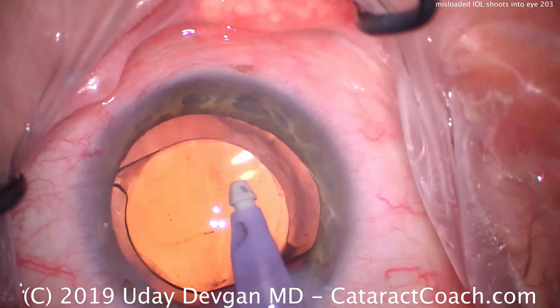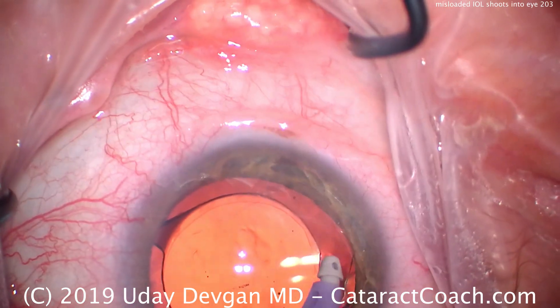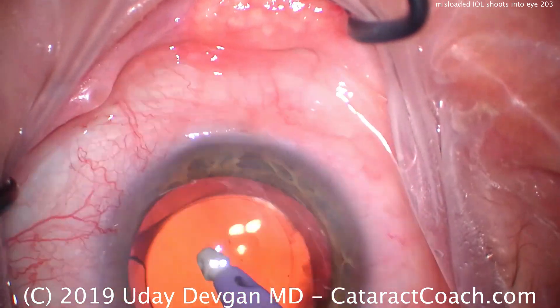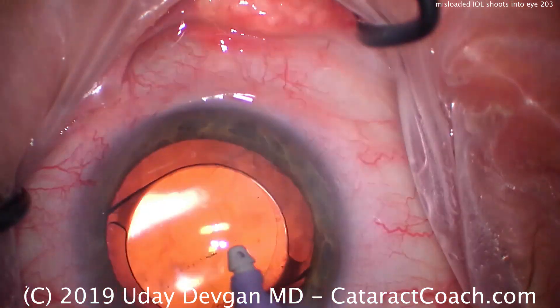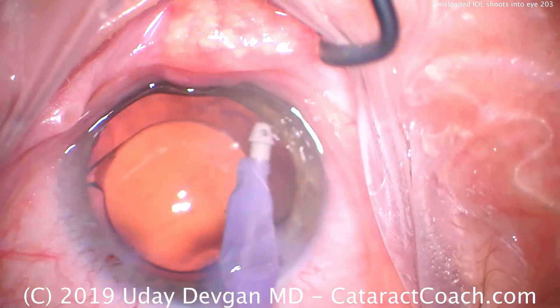So now we're centering up the lens here, removing the viscoelastic. And it looks pretty good. Now, if you look at the center optic of the lens, there's a faint little mark there. That's likely some opacity or fracture within the acrylic material of the lens.